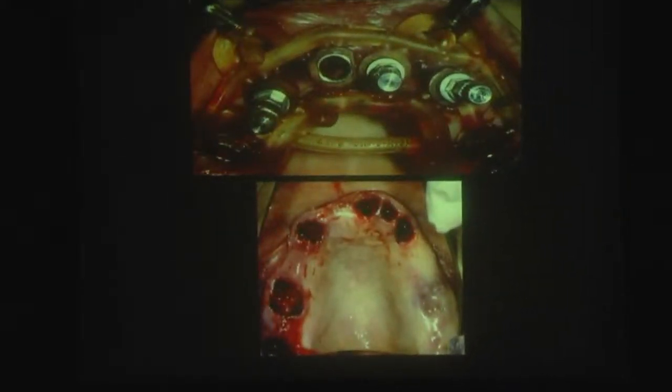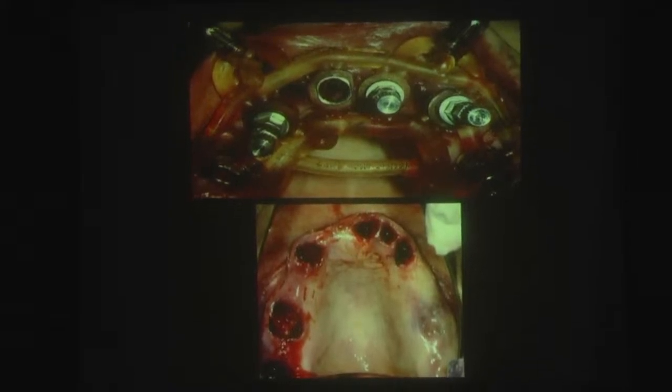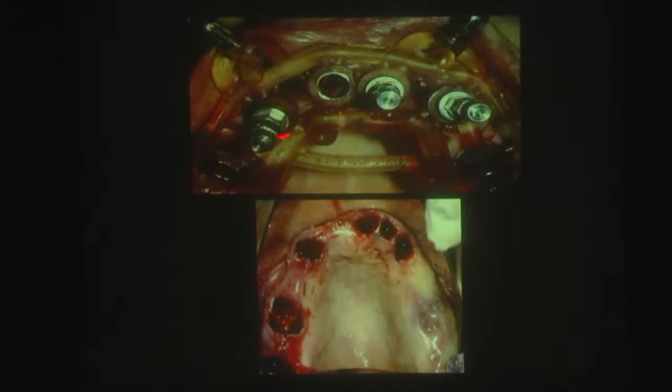We fixed the guide in 3 ways: 1 with fixation, 2 with socket anchorage, and the 3rd one, implant anchorage. In this picture, you can see the implant anchorage. Here, the implant is okay, the implant is okay, then we made the anchorage.